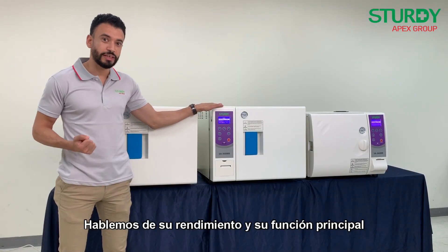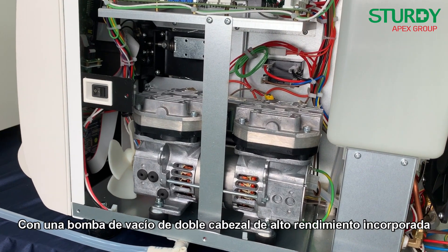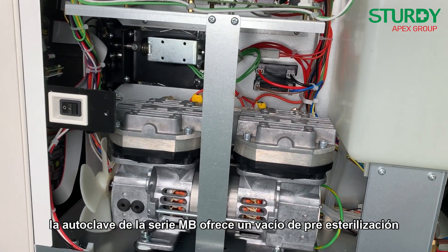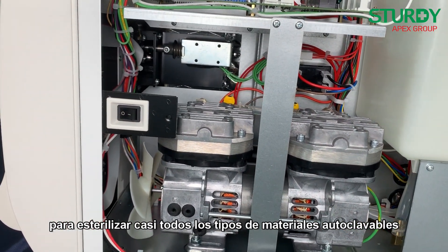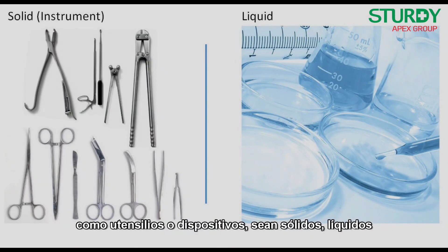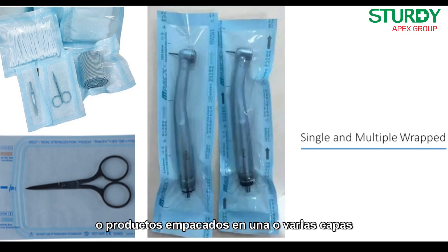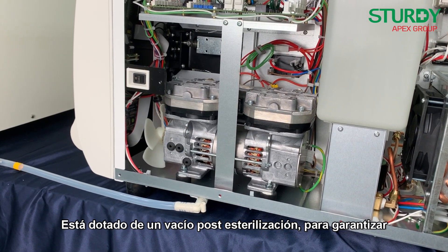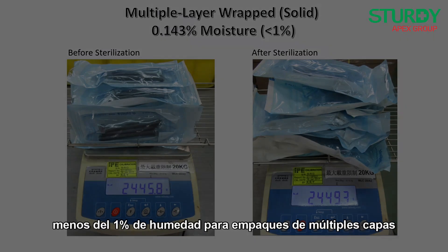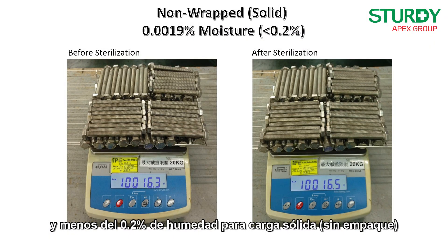Now let's talk about performance and key functions. With a built-in high-performance twin-head vacuum pump, the MB series autoclave offers pre-sterilization vacuum to sterilize almost all types of autoclavable materials commercially available, such as utensils or devices including solid, liquid, porous, lumen devices, and single and multiple layer wrapped products. It is also endowed with post-sterilization vacuum to guarantee less than one percent moisture for multiple layer wrapped products.